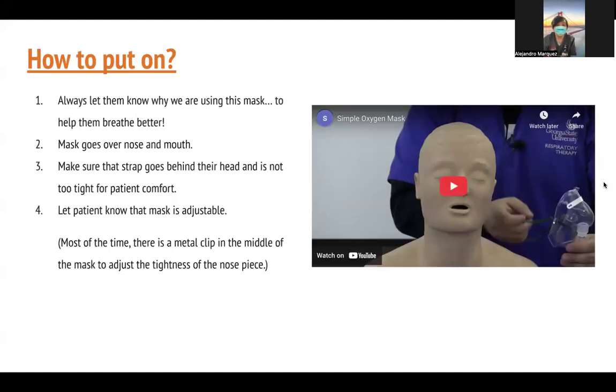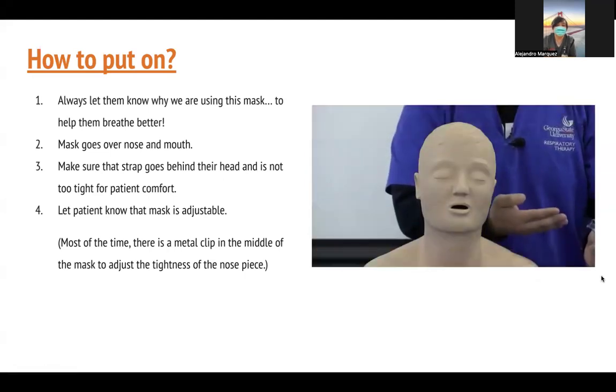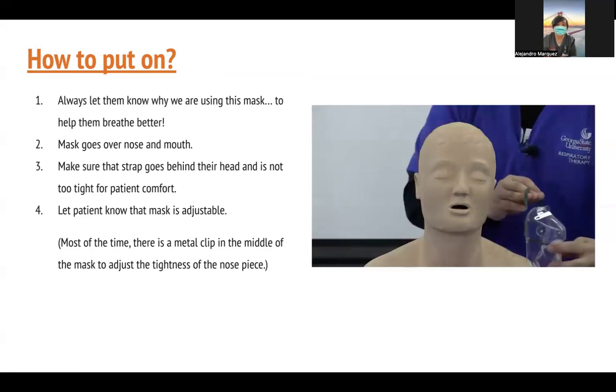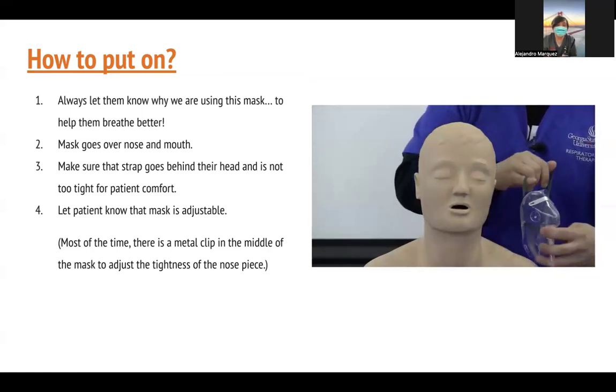How to put it on, I edited a little YouTube clip. It's like half a minute that we could watch while I talk about it. So how to put it on, you always want to tell the patient why they're putting on the mask. It's to help them with their breathing because there are definitely some patients that are confused. So always tell them what you're doing.